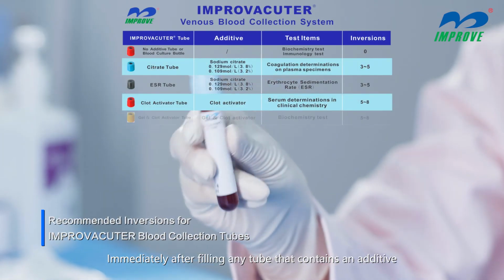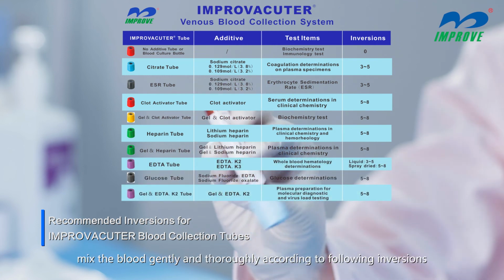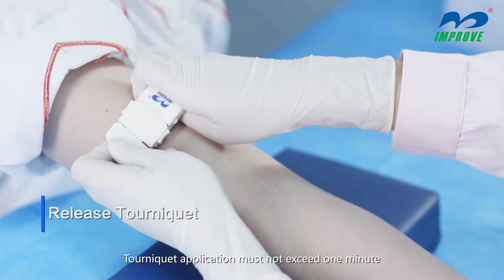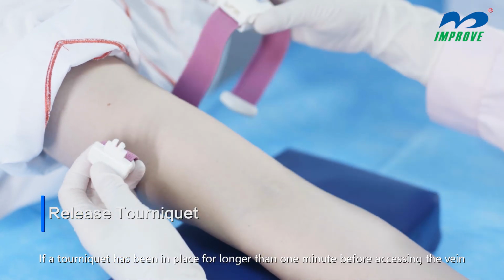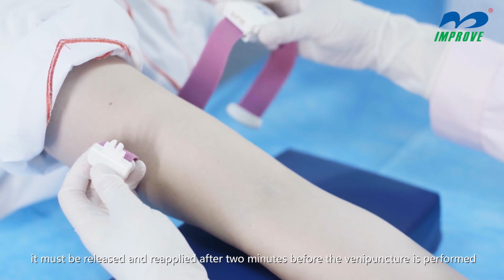Immediately after filling any tube that contains an additive, mix the blood gently and thoroughly according to the following inversions. Release the tourniquet. Tourniquet application must not exceed 1 minute. If a tourniquet has been in place for longer than 1 minute before accessing the vein, it must be released and reapplied after 2 minutes before the venipuncture is performed.